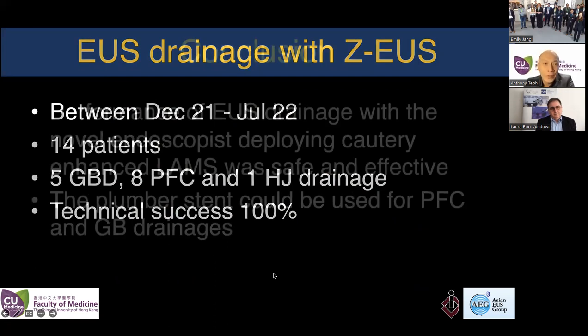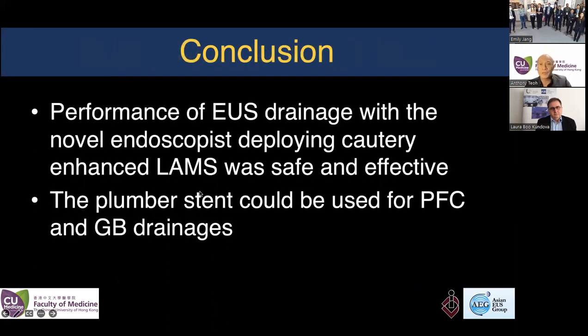So in conclusion, performance of EUS guided drainage with the novel endoscopist controlled cautery enhanced LAMS was safe and effective. And the Plumber stent could be used for all sorts of procedures, including PFC, gallbladder drainage, and even gastroenterostomy. So thank you very much for your attention.